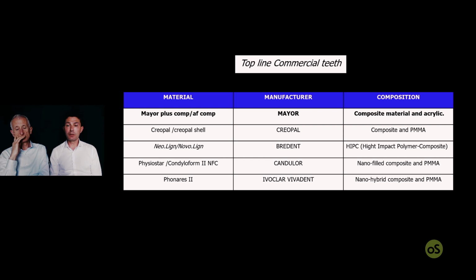This is because in the external surface of the teeth you have an inorganic material, and only in the external and last layer of the 5 layers. And this is important because the wearability resistance is good, and the polish for the anterior is good for a long time.